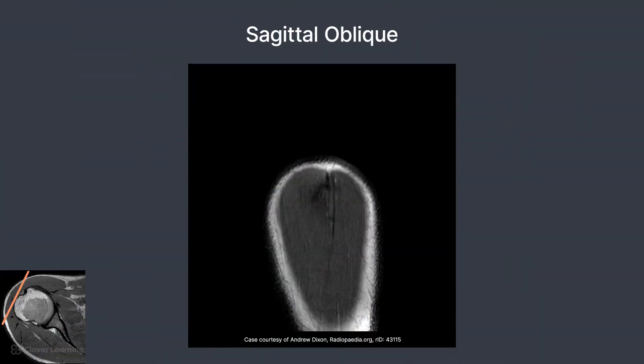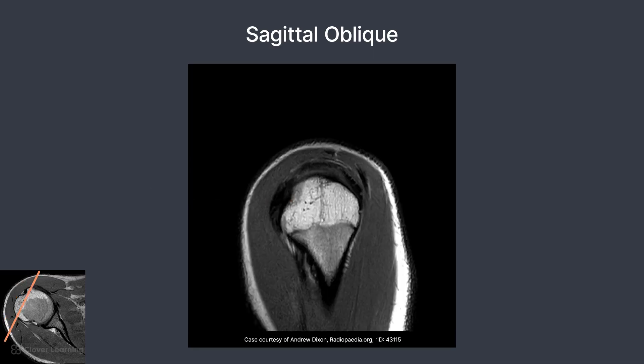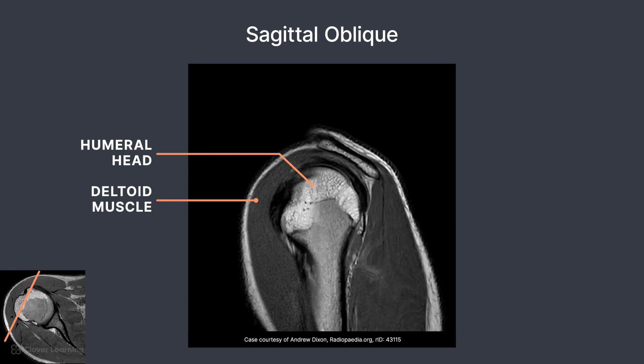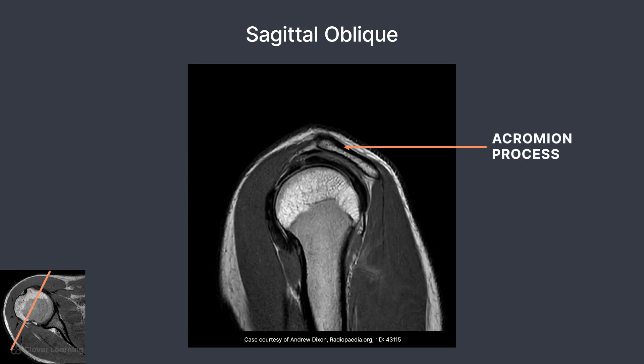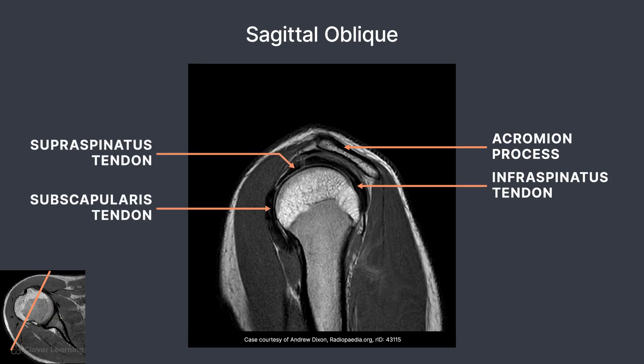Finally, let's take a look at a few sagittal oblique images. Starting laterally, the deltoid muscle is located centrally. Moving medially, the humerus begins to emerge, surrounded by the deltoid muscle. The acromion is demonstrated on the superior aspect of the joint. On this slice, we can see some specific tendons of the rotator cuff. The infraspinatus, supraspinatus, and subscapularis are demonstrated as dark areas surrounding the humeral head.